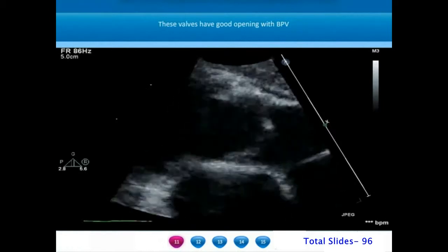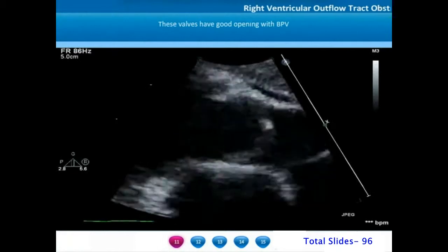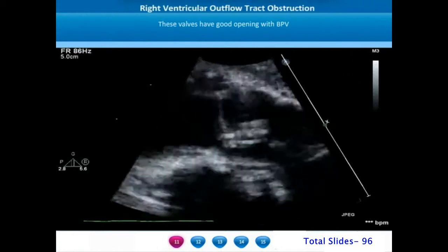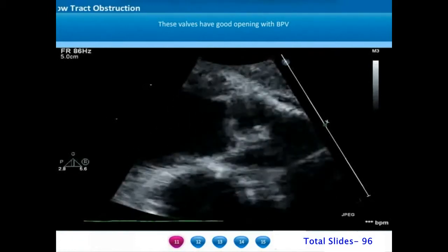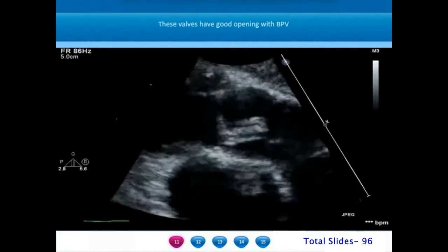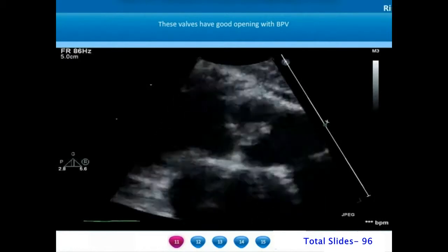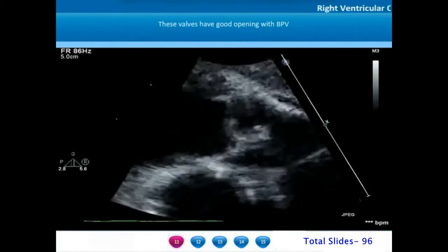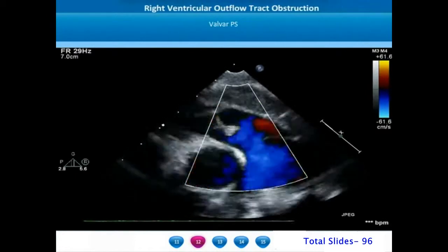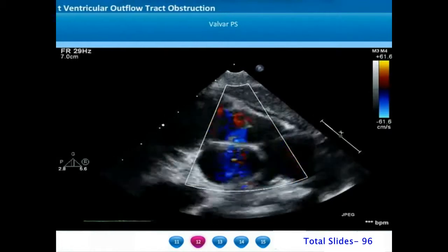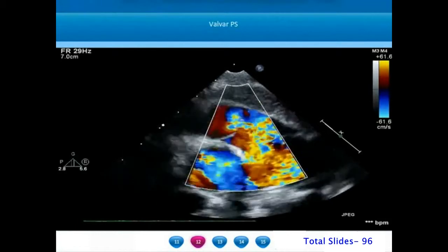In this magnified right ventricular outflow tract view obtained from the parasternal long axis, we can notice a good pliable doming pulmonary valve. These pliable pulmonary valves with good doming characteristics will have an excellent result after balloon dilatation. On color Doppler interrogation we can appreciate an extremely narrow jet of antegrade flow through the doming pulmonary valve, indicating the severity of the pulmonary stenosis.